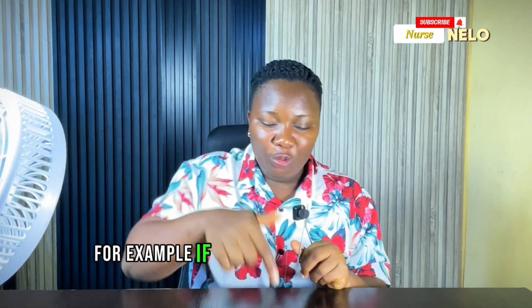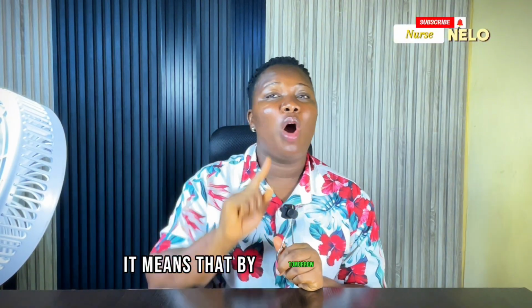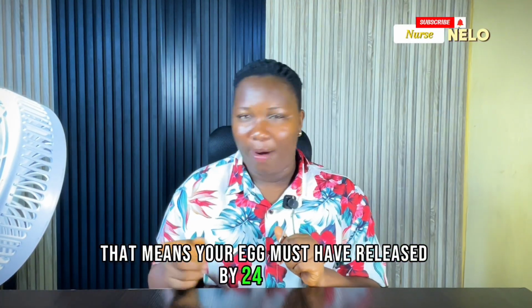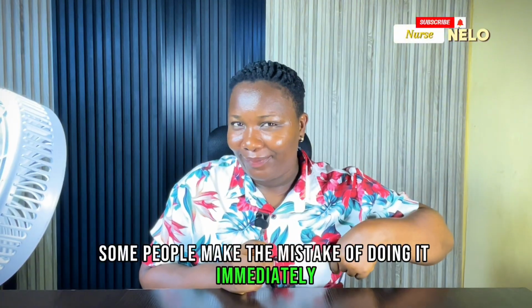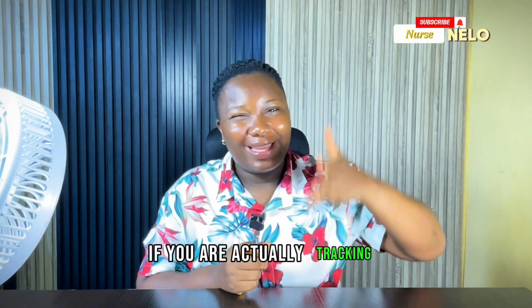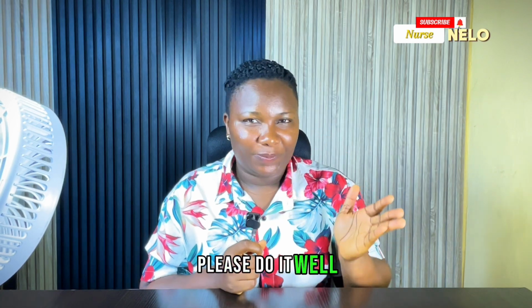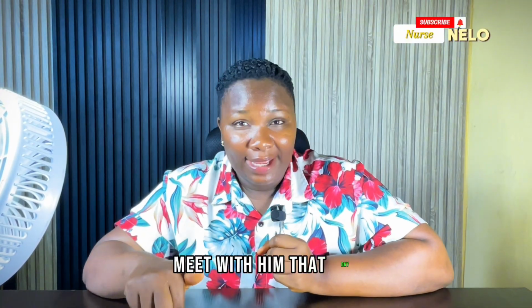For example, if you do it today and you get two sharp red lines, it means that by tomorrow, by noon, you should meet with your partner. That means your egg must have released by 24 hours. Some people make the mistake of doing it immediately. If you are actually tracking intentionally to get a male gender, please do it well. Do you understand? So when you meet with your partner 24 hours after you see these two sharp red lines, meet with him that day.